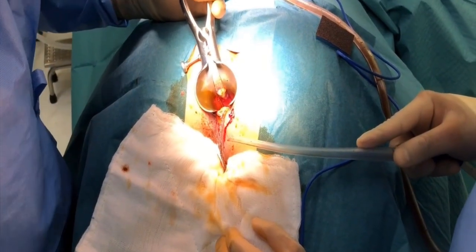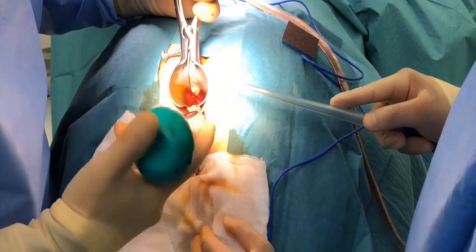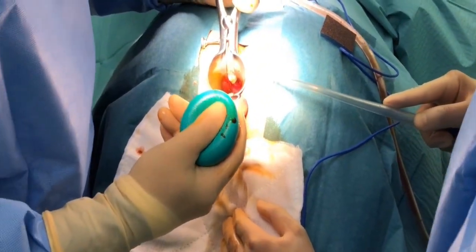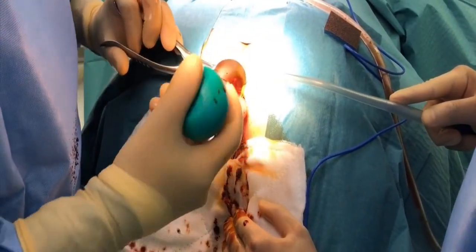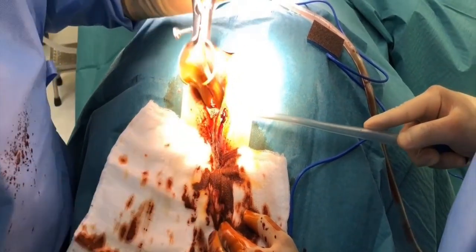A Pratt bivalve is used to inspect the anus. Betadine is injected through the abscess cavity to see if there is extravasation from an internal opening, and if a fistula tract is readily identified, consider the placement of a draining seton.